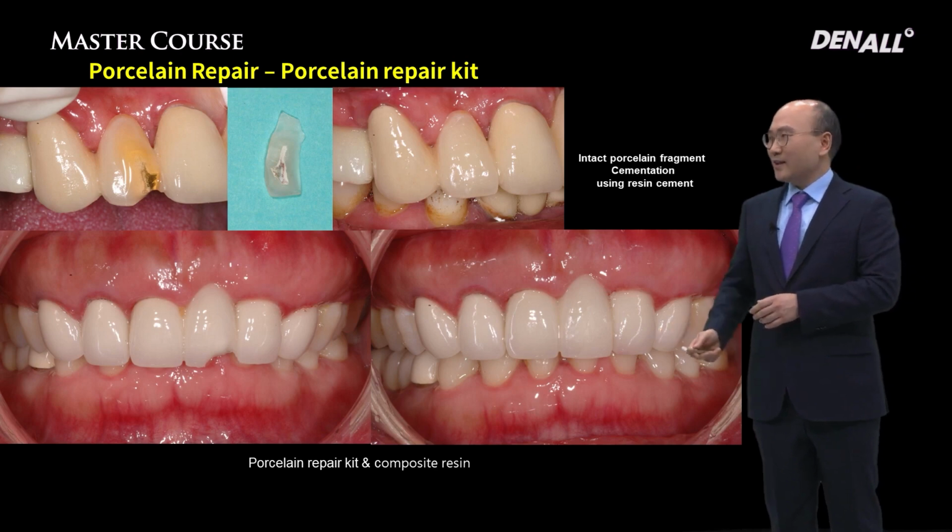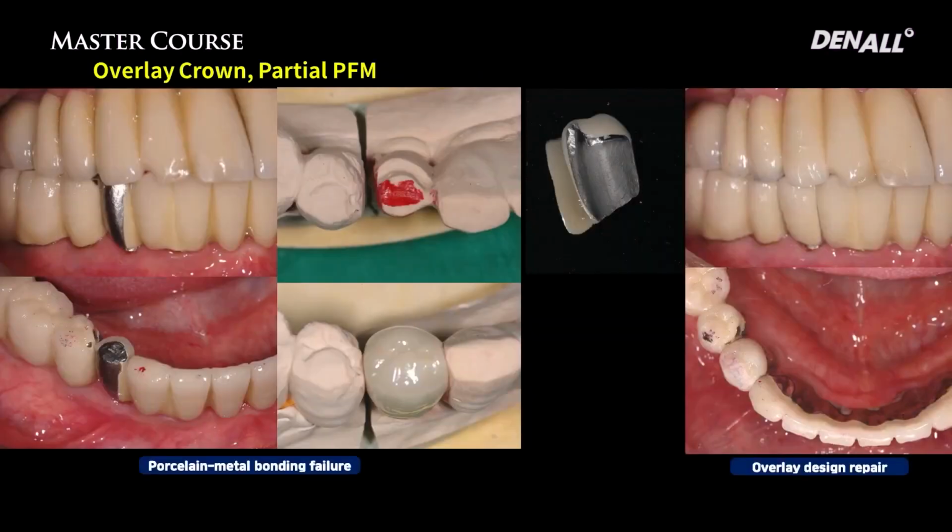So in this case, the implant on number 34 fractured, and food was stuck in there.